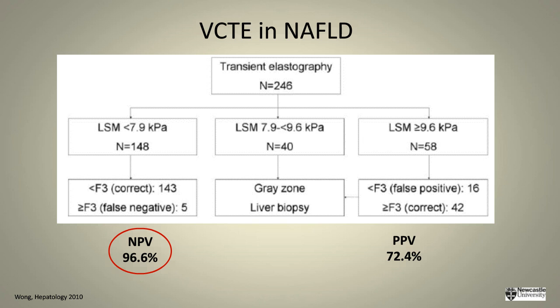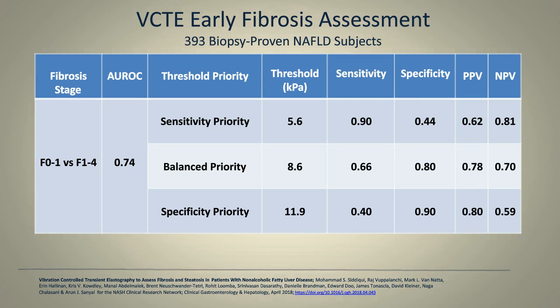But let's dive a little bit deeper into FibroScan and look at some of the published literature in the United States. Now, we've had data for a long time in Asia, even in Canada and in Europe, looking at the cutoffs for FibroScan, what works for Hep C, Hep B, what do we have for fatty liver. But I was really encouraged when we finally got some U.S.